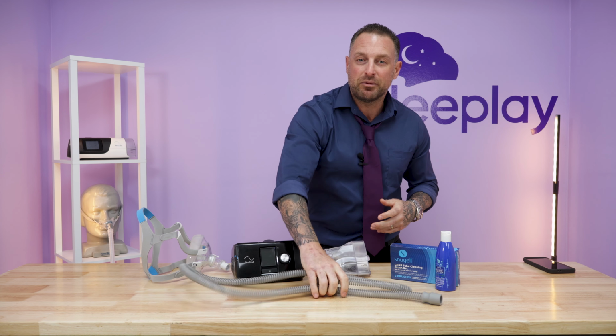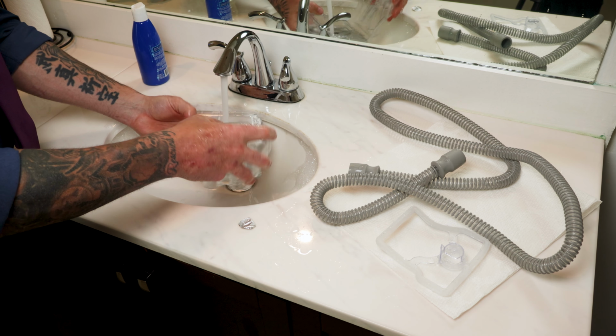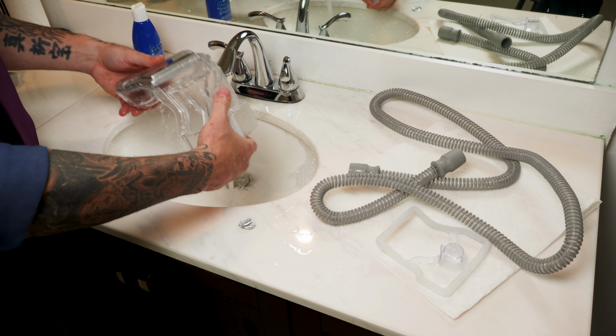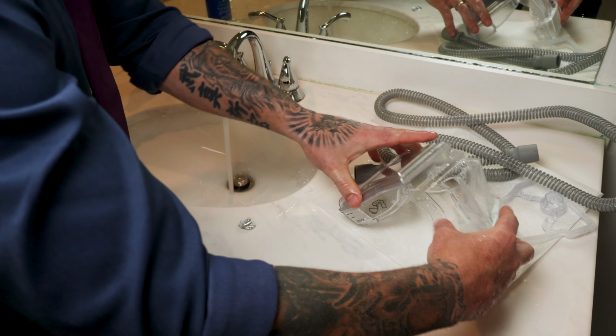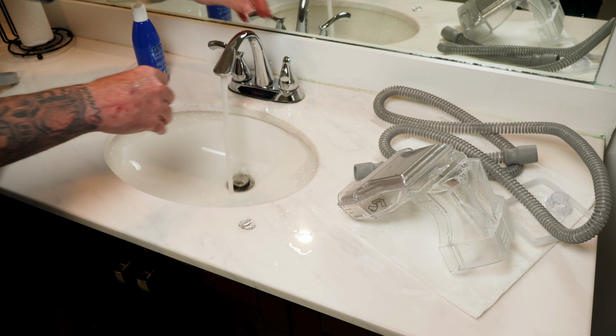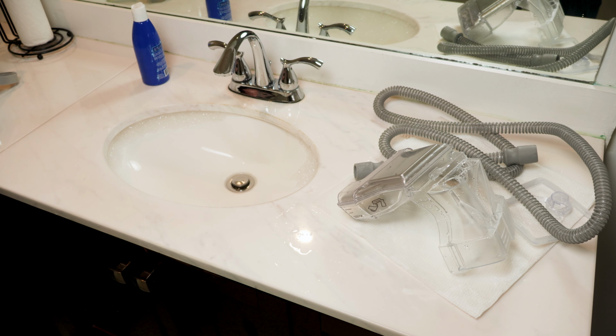As far as the water chamber goes, I've mentioned this before, you're going to open it up, and flip it upside down on that dry towel, right? And you're going to let it drip dry. You can even use the towel to clean and dry the inside of this as well, okay?